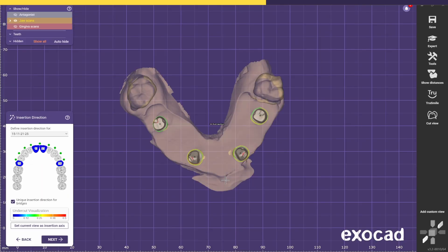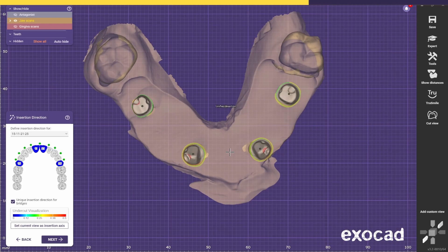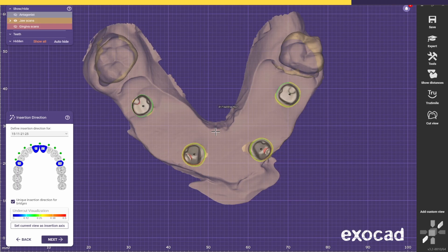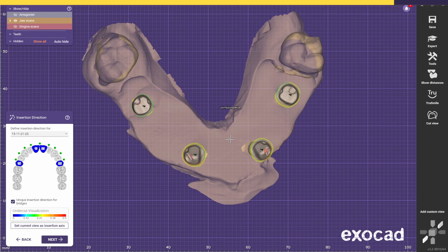Now because this is a cement retained bridge, we need to make sure that the path of insertion doesn't create any undercuts, so we don't end up with open margins. You need to find a point of view where you can see all the margins clearly. Something like this should be fine to make sure we don't have any open margins. Then we select Set Current View and go next.